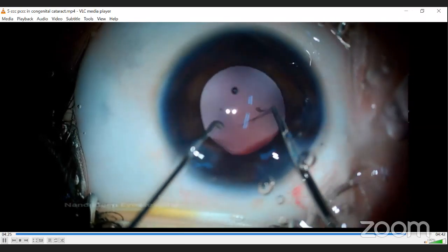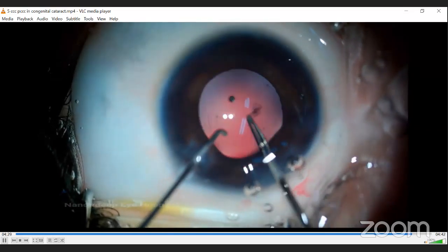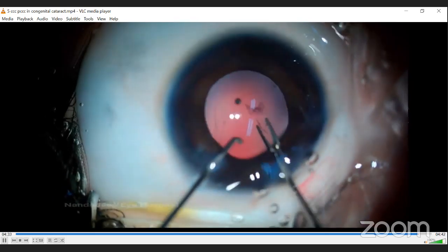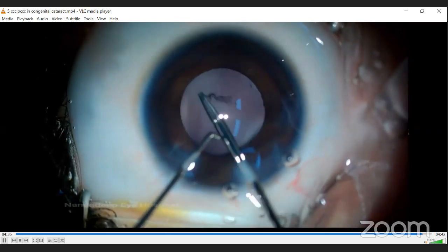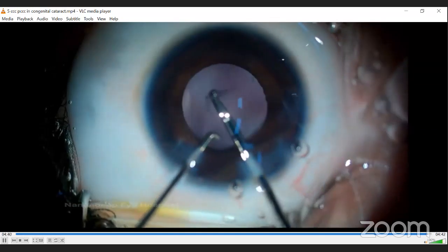You can see it is quite easy to do. Only one thing you have to make sure is that you never allow the anterior chamber to collapse, because the moment the anterior chamber collapses, the anterior hyaloid becomes convex and it gets torn. And then vitreous will prolapse into the anterior chamber. So that is the only thing which you have to avoid. So that's the end of the videos for this session. I will use some other session to discuss other videos.